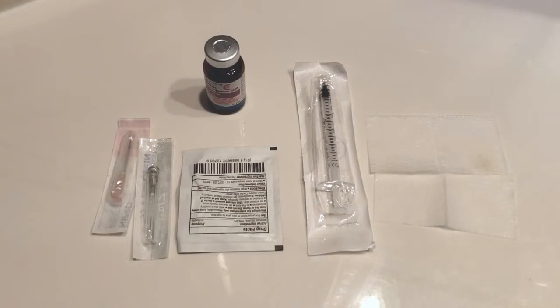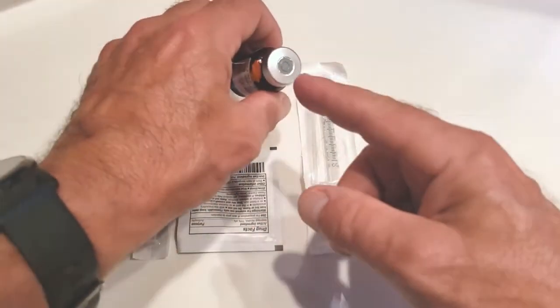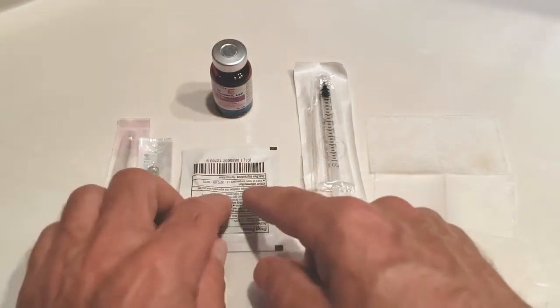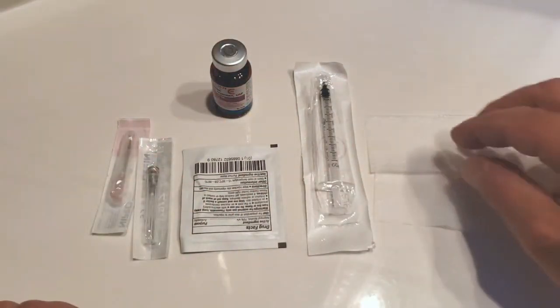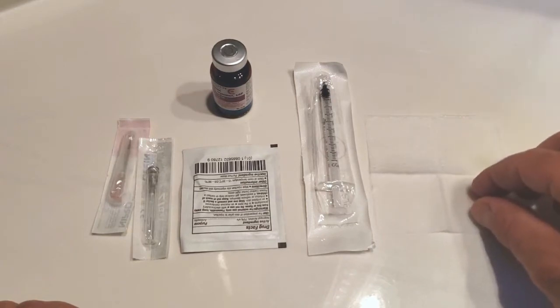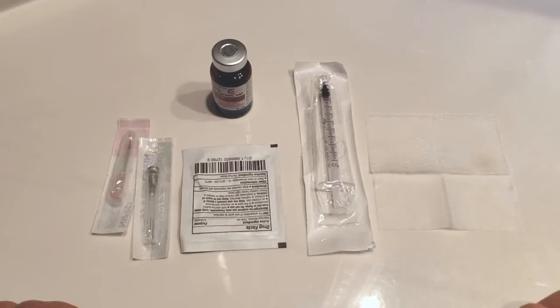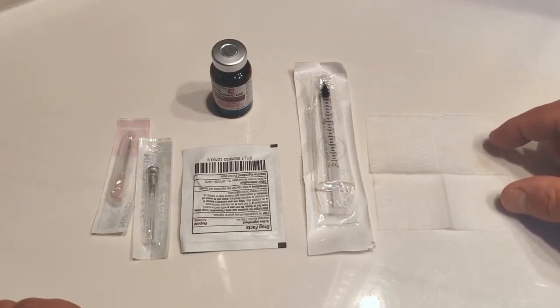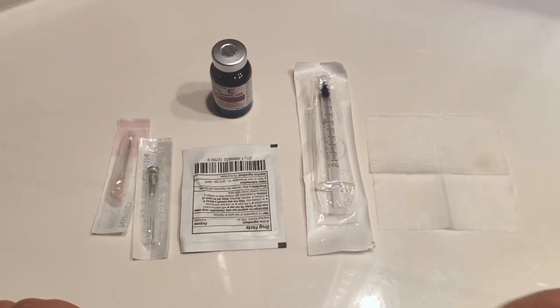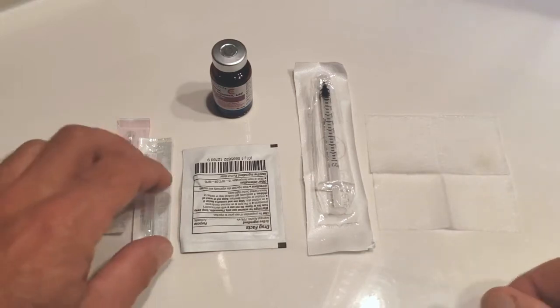Sterile technique is important to understand. There's bacteria on every surface — on the countertop, on the diaphragm of the bottle, on any surface you can touch. To follow sterile technique, you must not touch any sterile portion of equipment to an area that is not sterile. I like to make a little alcohol pad bed that can be used to set down sterile items on without breaking sterility.